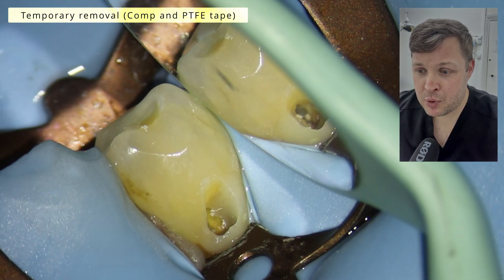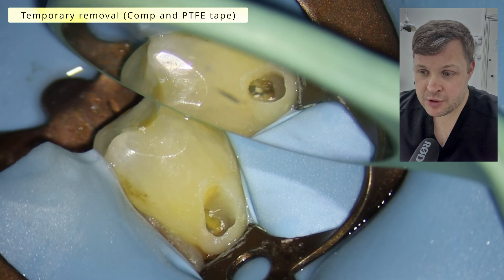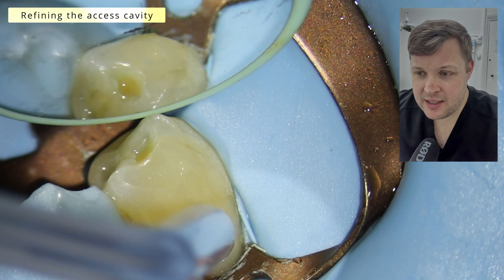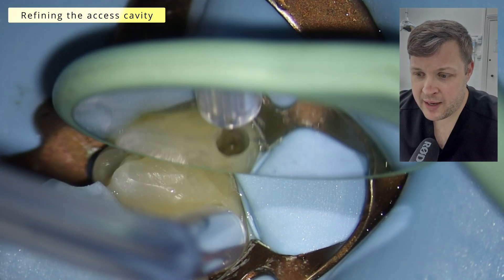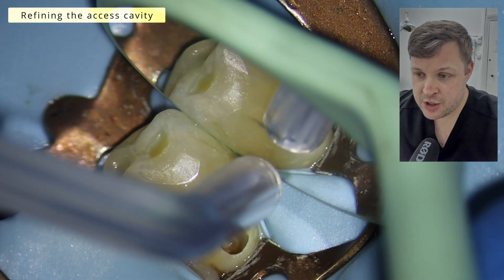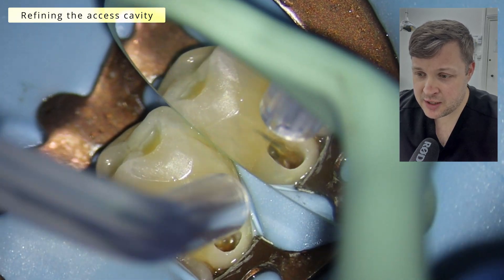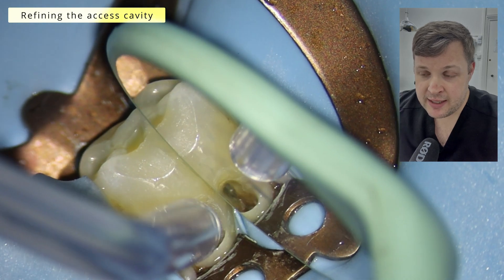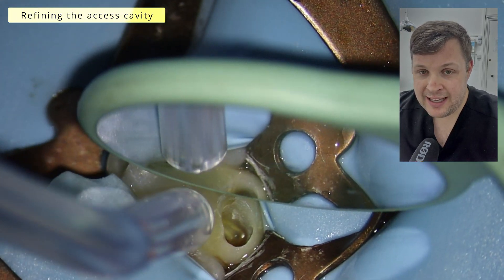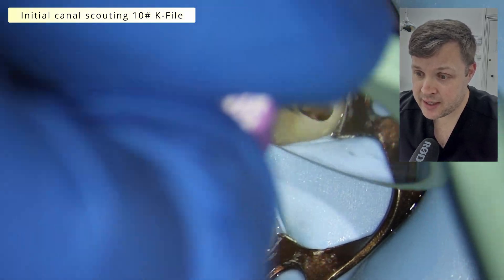I've done a buccal access rather than going through the top of the tooth. You might ask why — mainly to preserve tooth tissue, but it does have its challenges, especially with straight-line access. Sometimes it can be difficult to access the tooth if you're doing it at a 90-degree or near 90-degree angle.